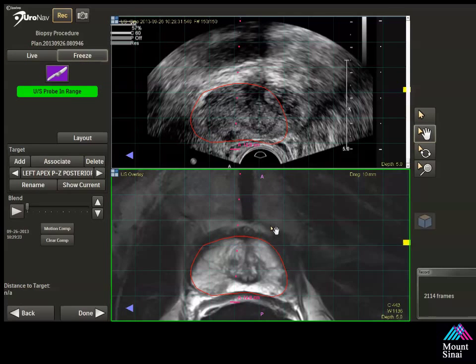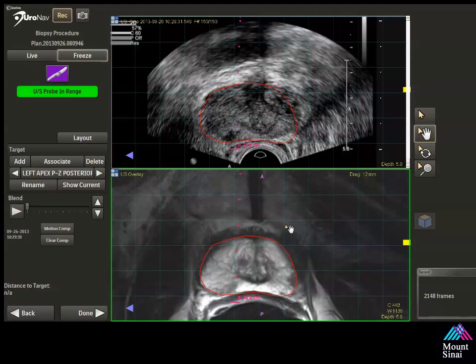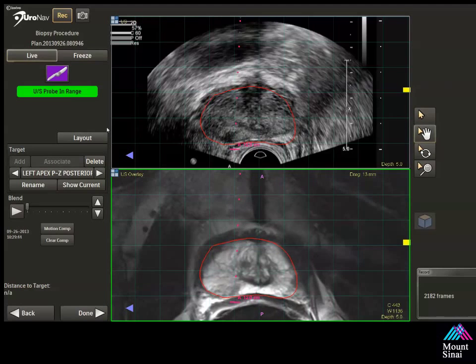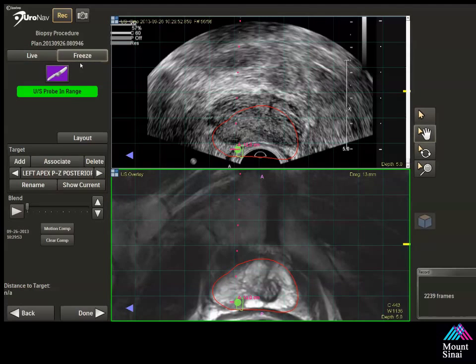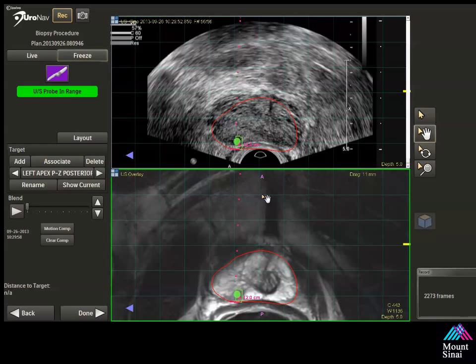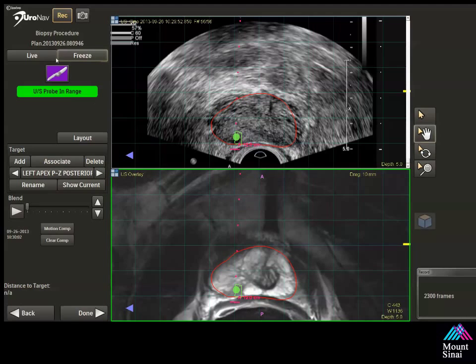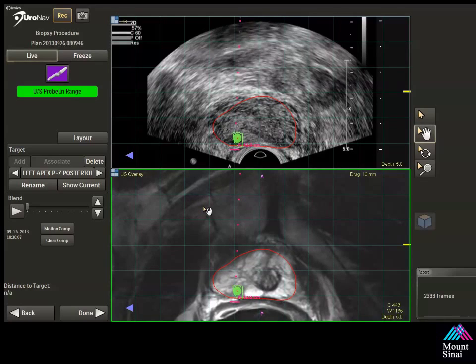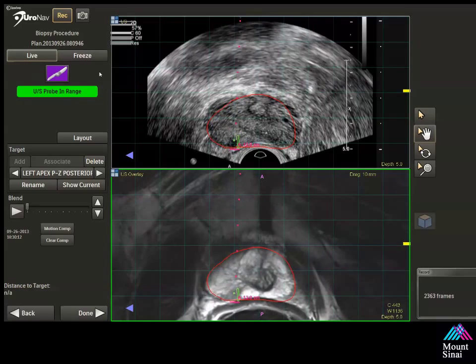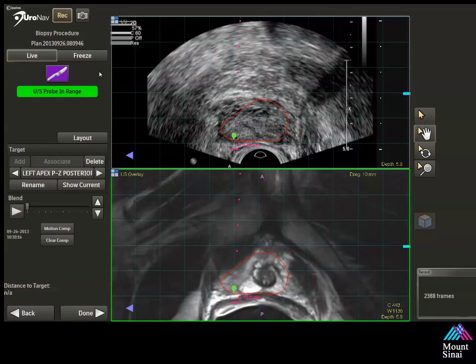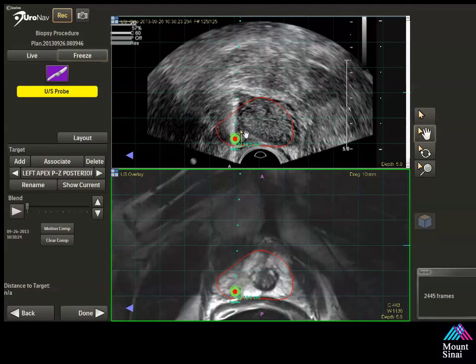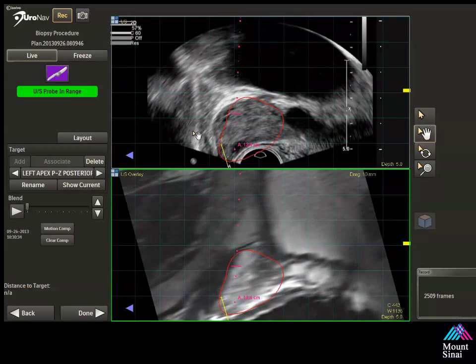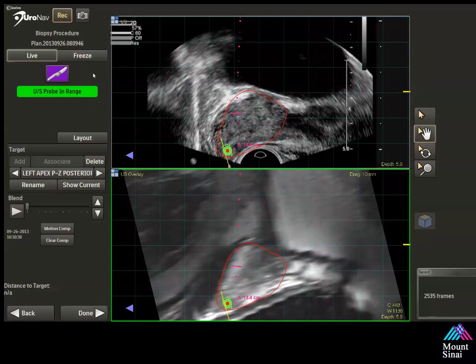We're going to line this up again. This is an uncut case — it allows you to really see what happens during the procedure. See how that lines up very nicely? I push, put pressure, release the pressure. I see that it's a hypoechoic lesion, but for the sake of the case I'm readjusting so we have a better representation of the fusion. Sometimes when you're performing the procedure, once you're convinced that the hypoechoic area is the lesion appreciated on MRI, you do not have to fine-tune the fusion as much — this could save you some time. I'm able to place the needle, fire it through the region, mark it and record it. This allows us to compare the prior imaging with the pathology obtained. It's really important to have pathology review so you know if you missed a lesion or the lesion was a false positive.